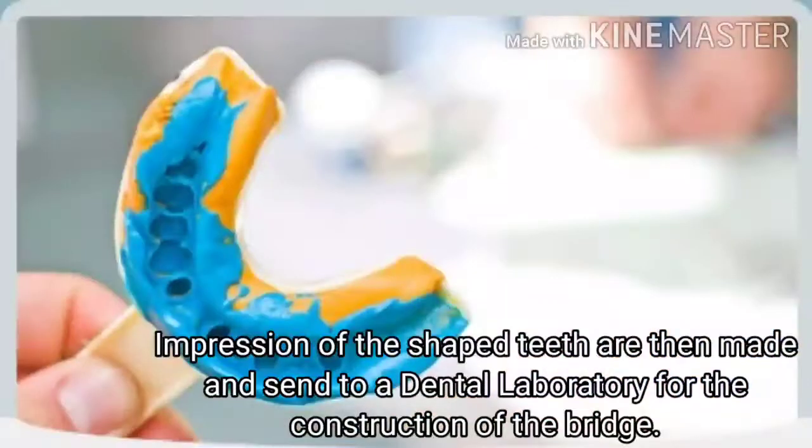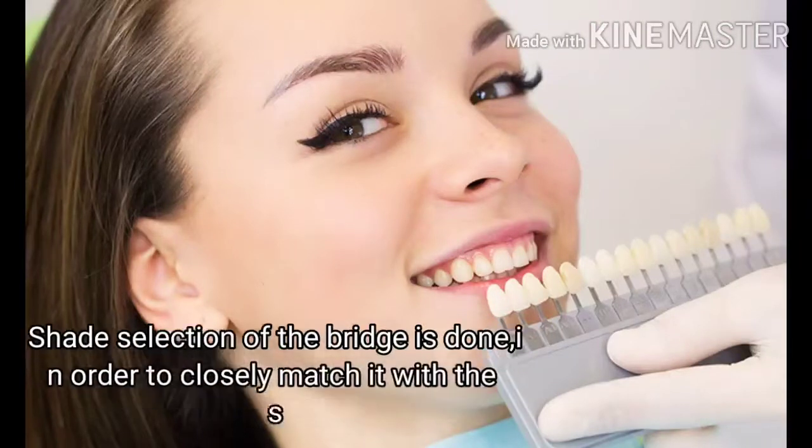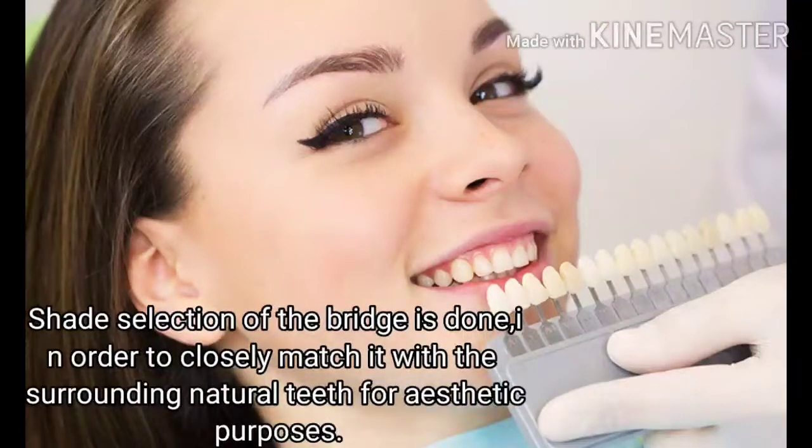Impressions of the shaped teeth are then made and sent to a dental laboratory for the construction of the bridge. Shade selection of the bridge is done in order to closely match it with the surrounding natural teeth for aesthetic purposes.